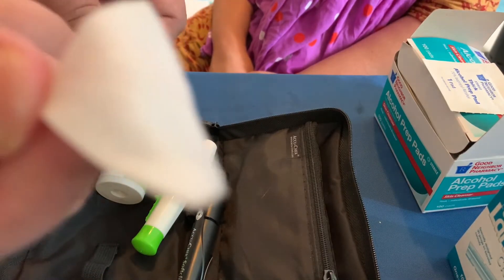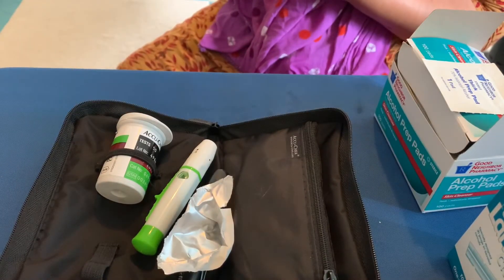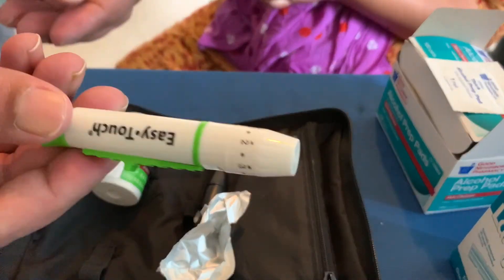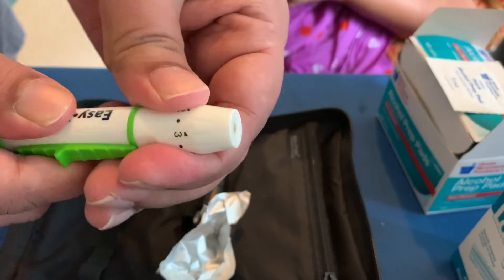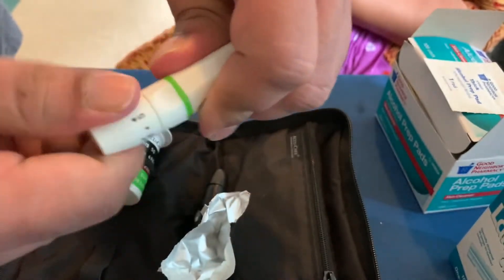This is how the alcohol pads look like. Clean your fingertips using it. Then you want to make sure you are ready with your needle — it's called the Easy Touch needle. It's really easy to use.